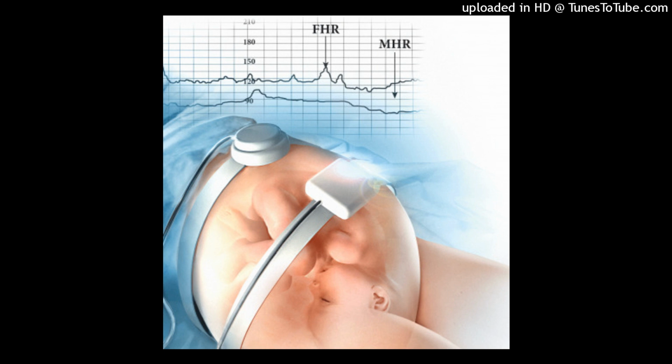Limitations of ultrasound and tokodynamometer transducers. The limitations of ultrasound and tokodynamometer transducers are as follows. Limit maternal mobility. Frequent repositioning of transducers often needed to maintain readable, accurate tracing. May double count a slow FHR of less than 60 bpm, resulting in an apparently normal FHR during a bradycardia, or may half count a FHR greater than 180 bpm, resulting in an apparently normal FHR during tachycardia.